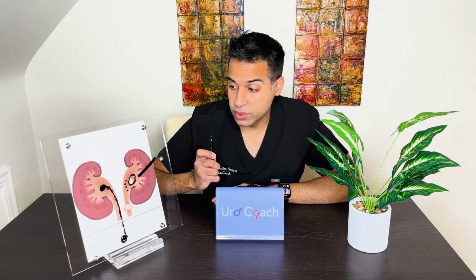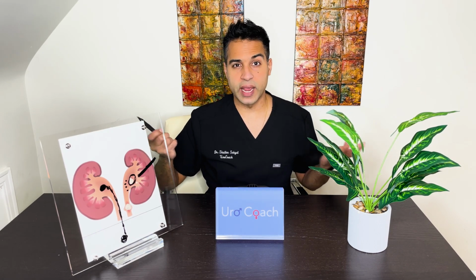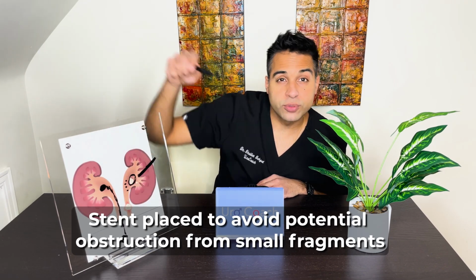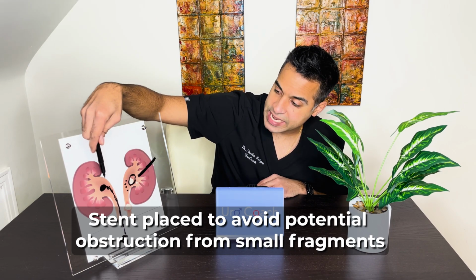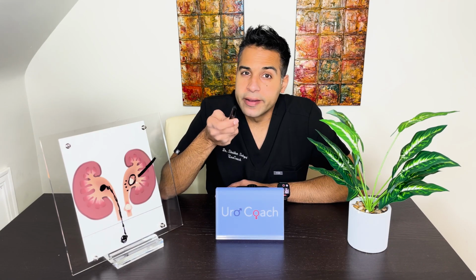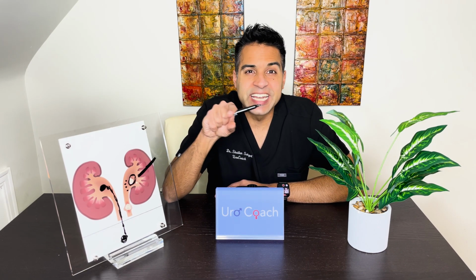So oftentimes what we'll do is we say, you know what, this is a big stone that we're working on in the kidney, even if it's not with a scope, a ureteroscopy, so we're not going through the ureter. But I think there may be an impending obstruction when we start working on it. It's kind of like tickling the dragon's tail, right? So we'll place a stent from the kidney down to the bladder so that if this obstruction were to happen, there's a way for urine to get from the kidney down to the bladder. And then we keep it in until we get some imaging over time. Say, you know what, it looks like the stone's cleared, then we pull that stent out. So it's to kind of obviate or prevent a problem from happening when we work on a non-obstructive stone. So that's another reason why stents are really, really important.